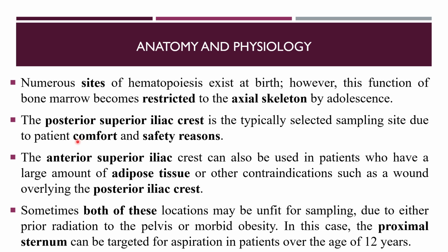In some patients, the amount of adipose tissue is very high in this specific place. In those patients, we can also collect the sample from the anterior superior iliac crest, and that is also fine.